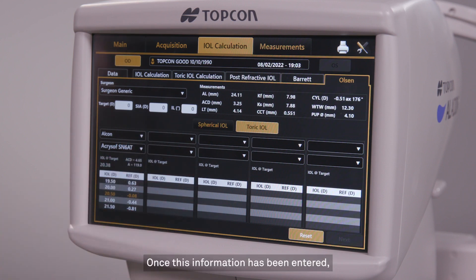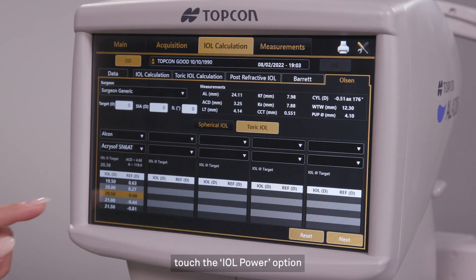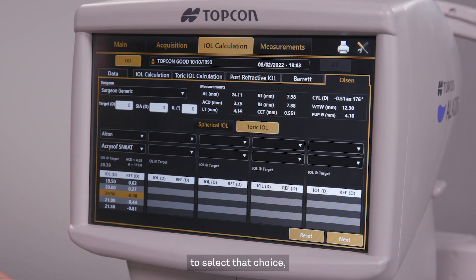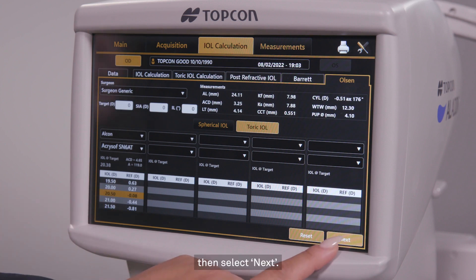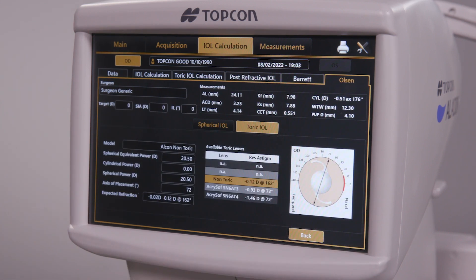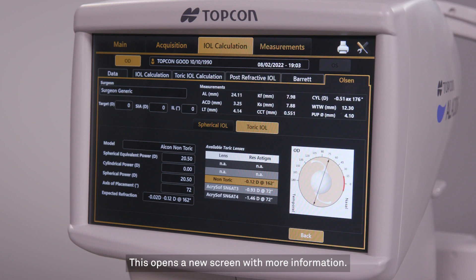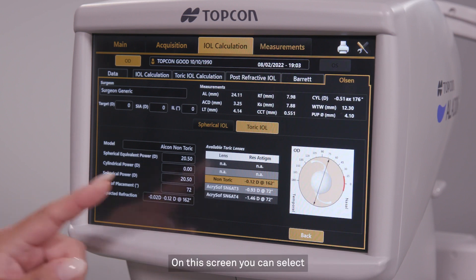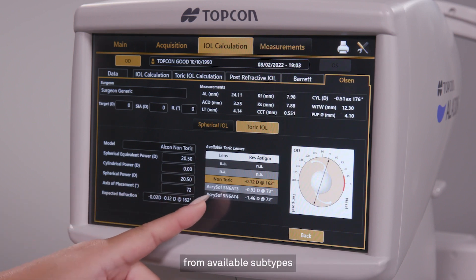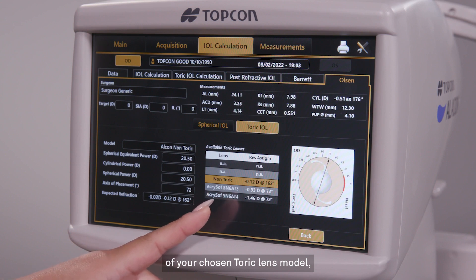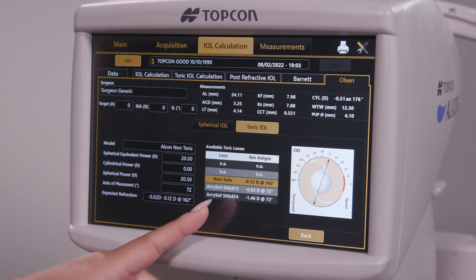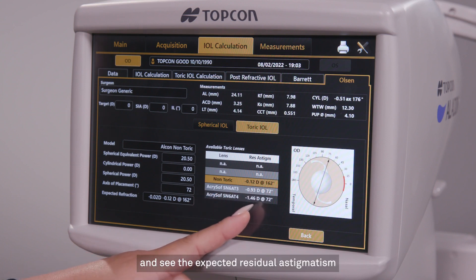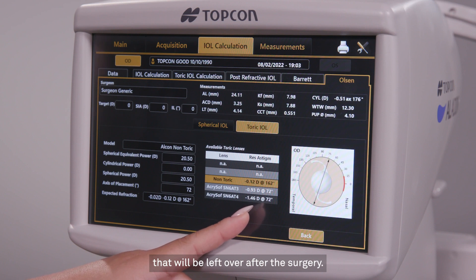Once this information has been entered, touch the IOL Power option to select that choice, then select Next. This opens a new screen with more information. On this screen, you can select from available subtypes of your chosen toric lens model and see the expected residual astigmatism that will be left over after the surgery.